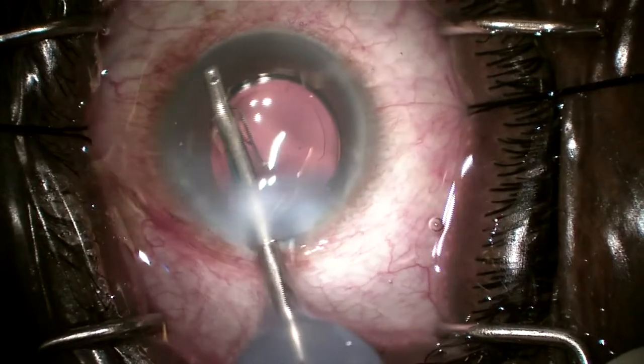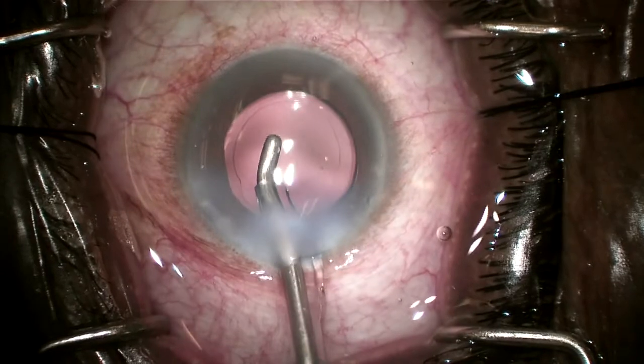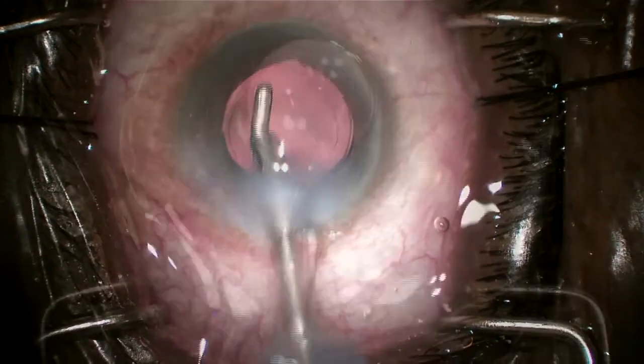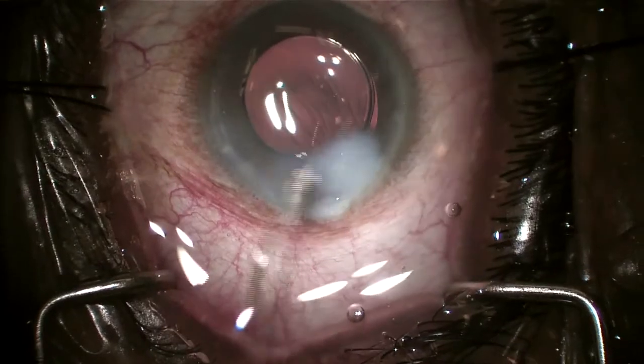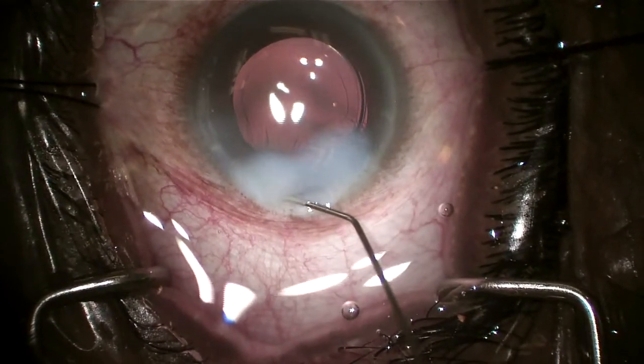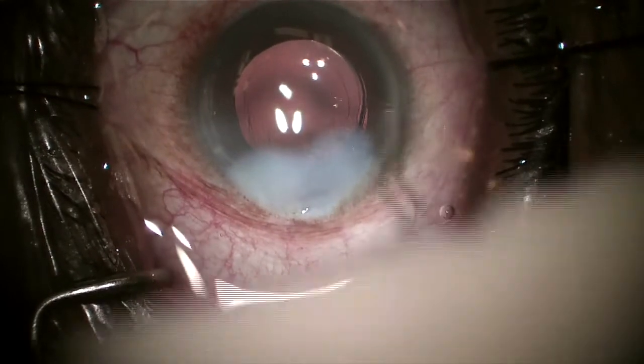Now I'm removing viscoelastic with my automated I/A and completing the cataract surgery as routine. What's important at the end of these cases is to make sure you hydrate those wounds. I hydrate the main wound, but I also like to hydrate that secondary wound that we created for the Hydrus and the Omni device as well.